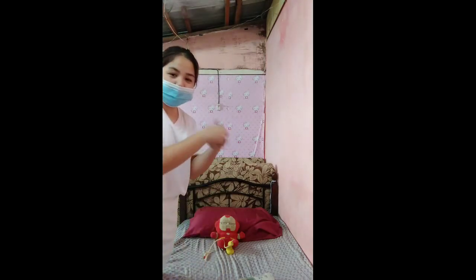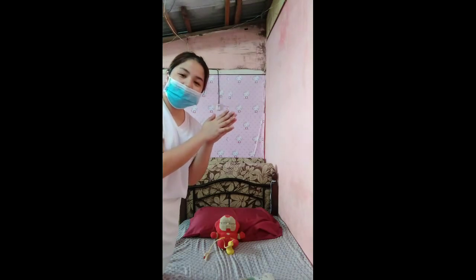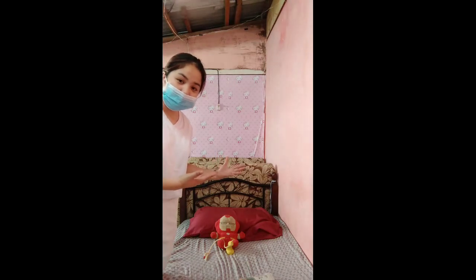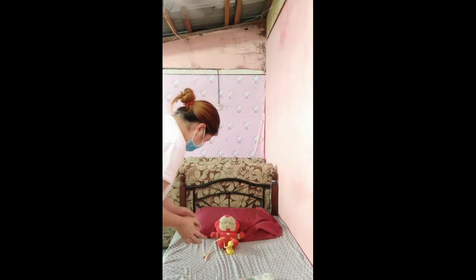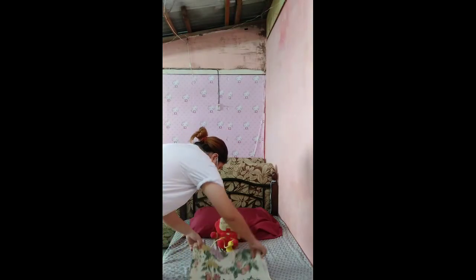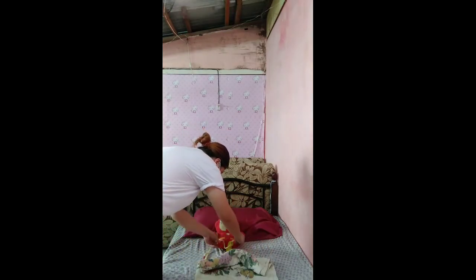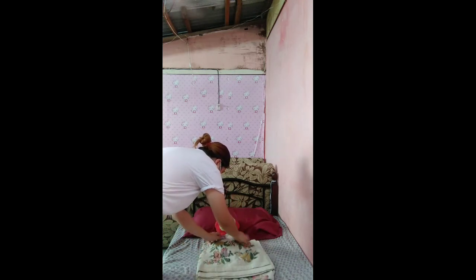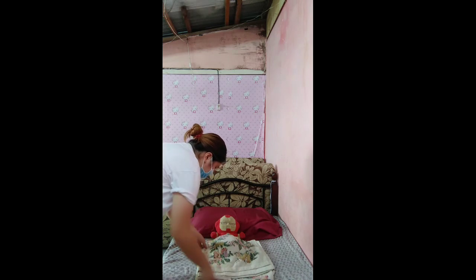After performing hand hygiene or putting alcohol on our hands, we need to position the patient in a comfortable position. So, sir, we are done. You can put your legs down and relax. Okay.